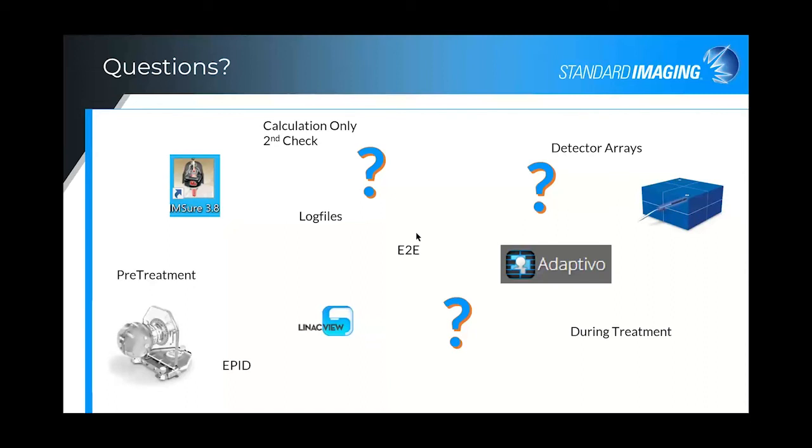And so then, for the cases in which the patient is on the couch, you can see your setup differences, for example, if the patient isn't aligned properly, and you can also determine variation in the patient anatomy as time goes on, using the 2D gamma analysis.